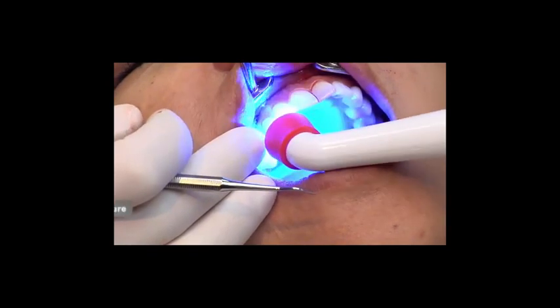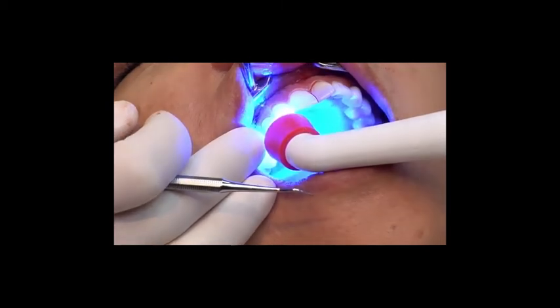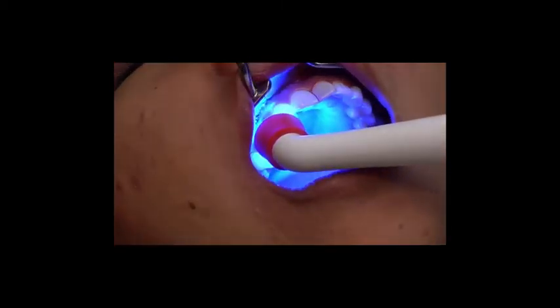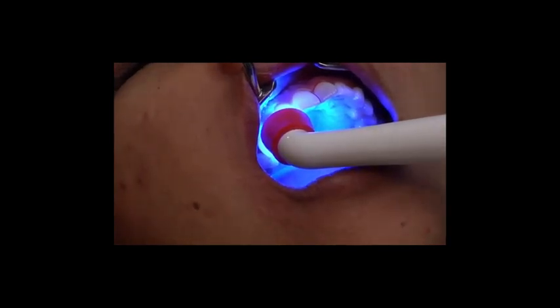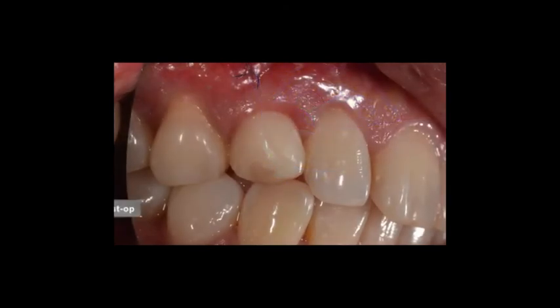So here's the light curing of the composite restoration in the screw access hole. And so this then completes the surgical phase of this treatment. Very straightforward, one-step surgery, placing the implant immediately, bone grafting, again with that apical incision.